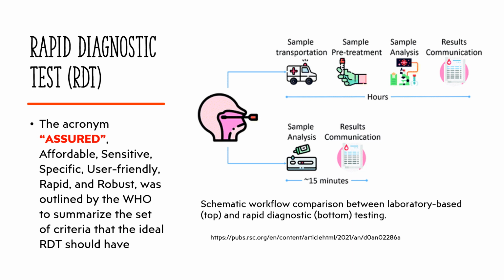The acronym ASSURED, which stands for affordable, sensitive, specific, user-friendly, rapid, and robust, was outlined by the World Health Organization to summarize the set of criteria that the ideal rapid diagnostic test should have. Here is a schematic workflow comparing the laboratory-based testing and rapid diagnostic testing.